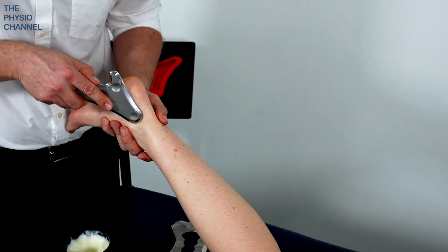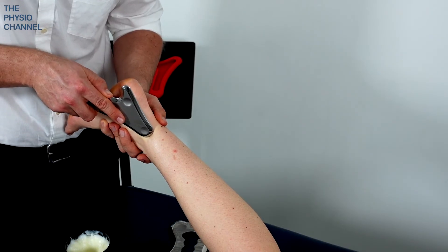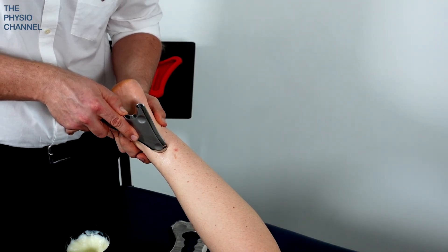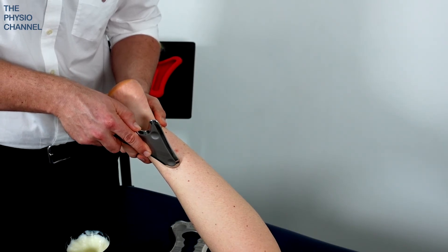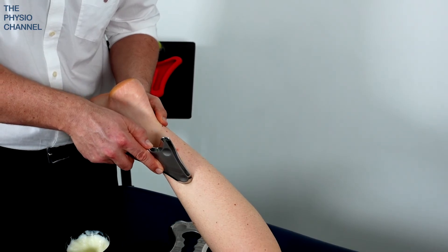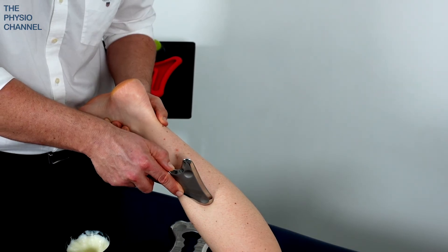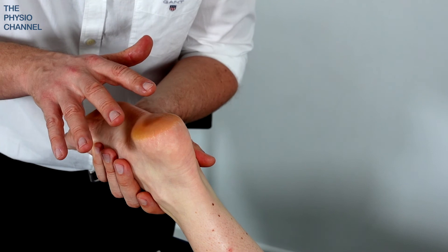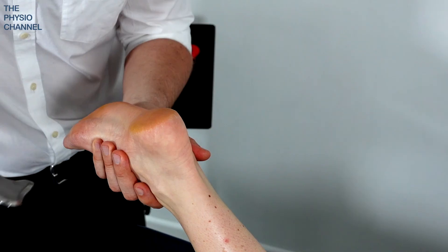When you track up the tibialis posterior tendon, if you want to track up over the muscular region behind the tibia, you can continue up the lower leg using the posterior tibia as your guide as you make your way up towards the back of the knee. With this treatment we're focusing on the plantar fascia, but it is a good idea to expand your treatment to the lower limb.